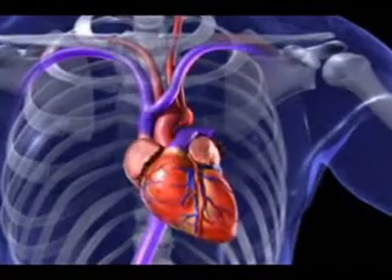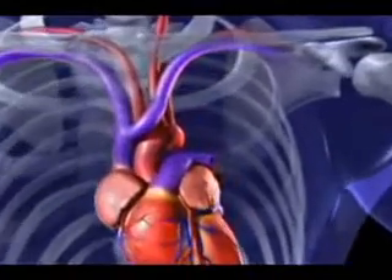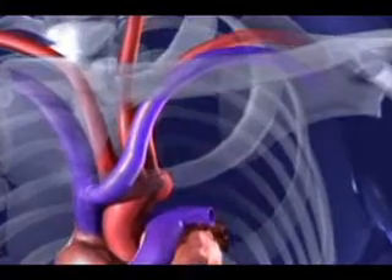The animation shows the top part of the device to which the wires are ultimately connected after being inserted into the heart.